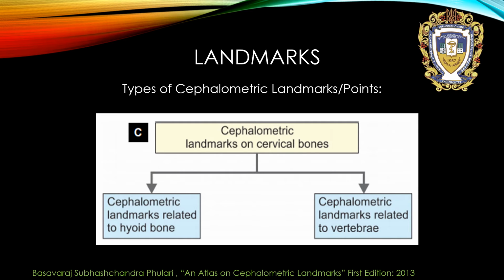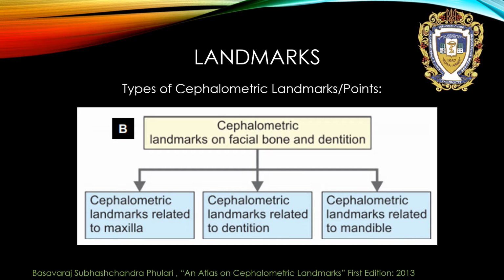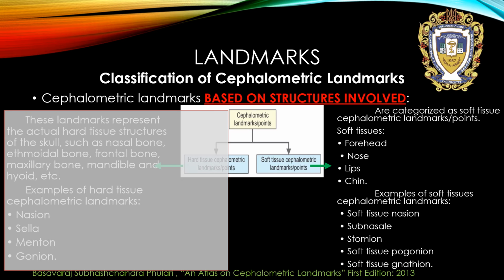Landmarks on cervical bones, related to hyoid bone or vertebrae. Moreover, landmarks on facial bone and dentition are divided into those related to maxilla, to dentition, and to mandible. And soft tissue cephalometric landmarks.